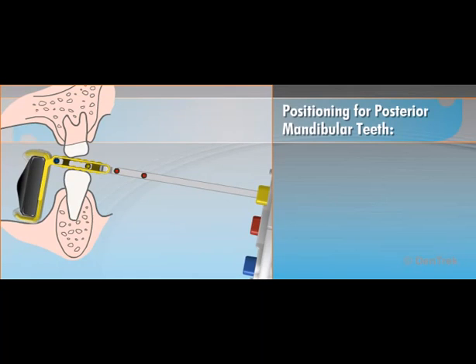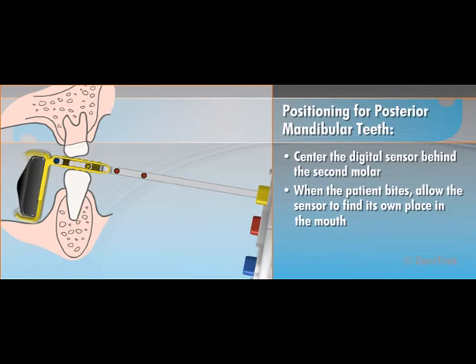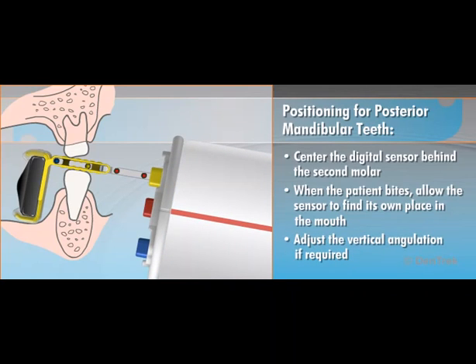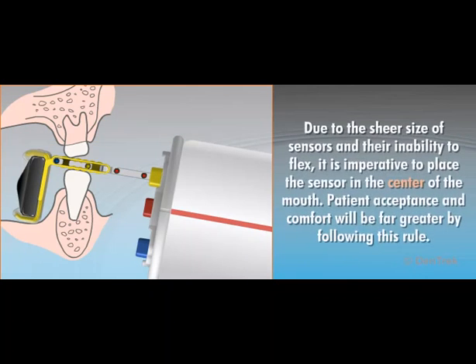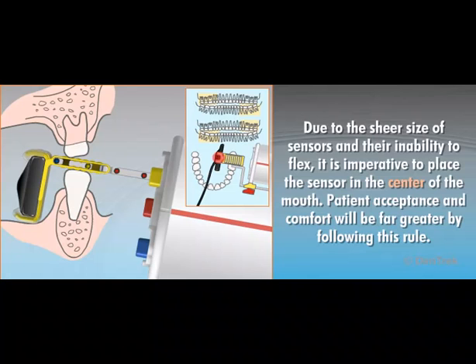For posterior mandibular teeth, center the digital sensor behind the second molar. The lingual position of the sensor should be as medial as the tongue attachment will allow so that the anterior border of the sensor aligns with the distal portion of the second premolar. When the patient bites, allow the sensor to find its own place in the mouth, guiding the positioner into place and again adjusting the vertical angulation if required. Due to the sheer size of sensors and their inability to flex, it is imperative to place the sensor in the center of the mouth. Patient acceptance and comfort will be far greater by following this rule.